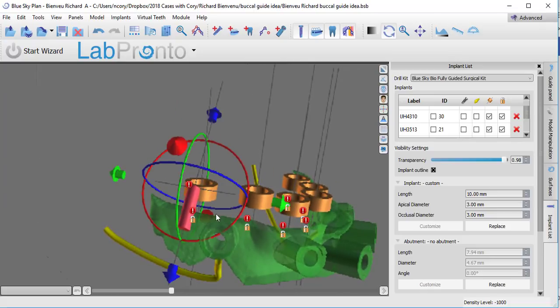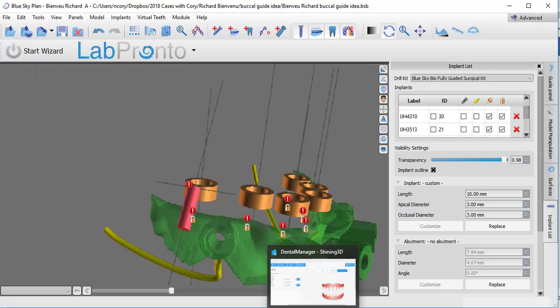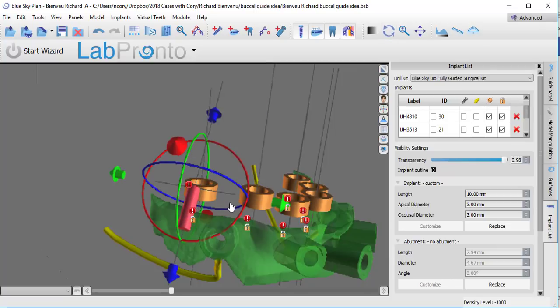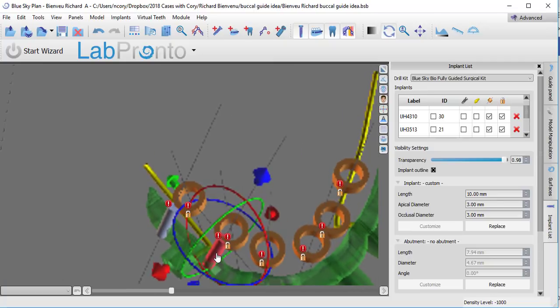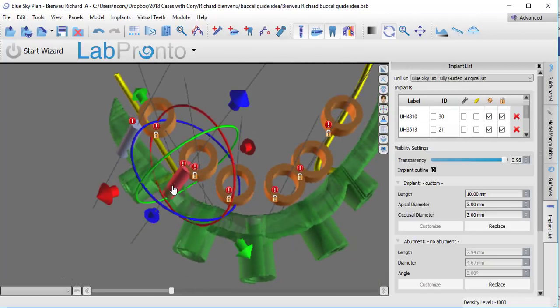And in the process of exporting it together, whatever you have checked on at that time, and we're going to leave all these tubes, plus this guide, plus these connecting implants checked on, is going to turn them into a single STL. So you'll see when I get to that step. Now, to move along, we're going to duplicate this, and I'm going to pull another one over here. And I'm going to connect each guide tube to the reduction guide.